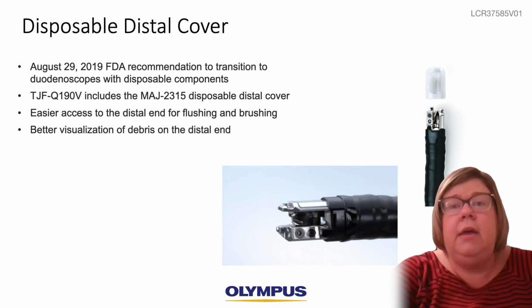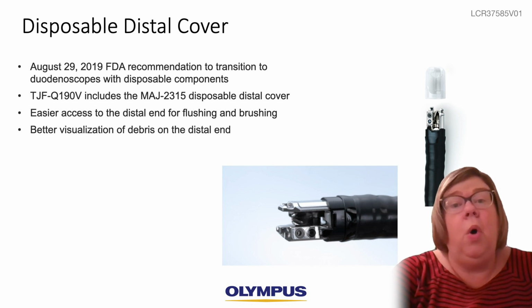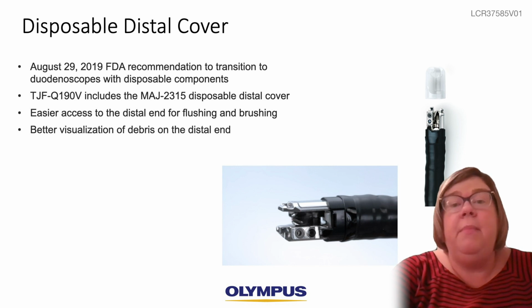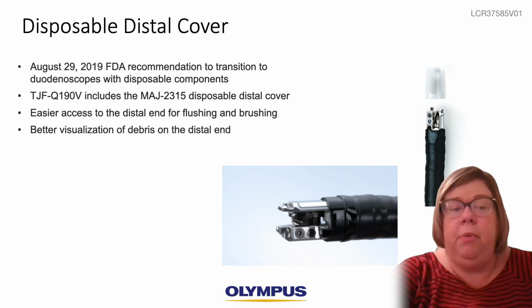Many times for me, that meant passing on to the tech in the decontamination room the amount of stone and sludge in the case to remind them that it may require some extra brushing during their manual cleaning phase. Or worst case scenario, I was the one reprocessing that scope on the weekend, and I knew just the extra work it would require of me during the manual cleaning phase to visually inspect and make sure that all the stone and sludge and debris were removed.